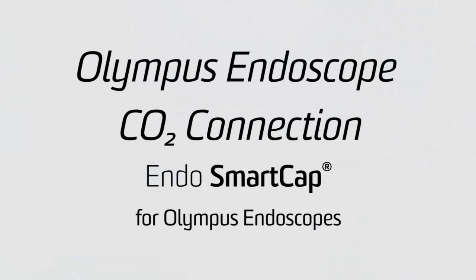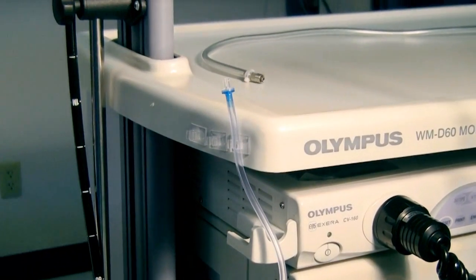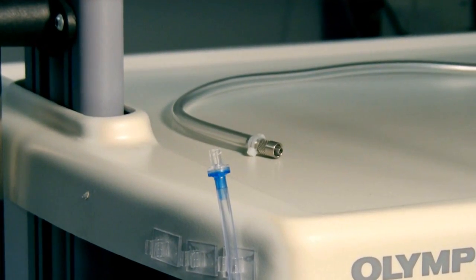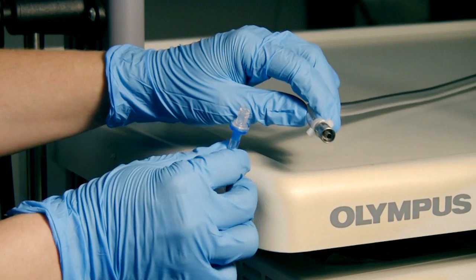Included in the Smart Cap family is the ability to use CO2 versus normal air. When using a CO2 Smart Cap, simply luer lock your CO2 Smart Cap to your CO2 connection. The Smart Cap CO2 is equipped with a one-way valve, which will only allow the gas to flow in one direction and pressurize the bottle.